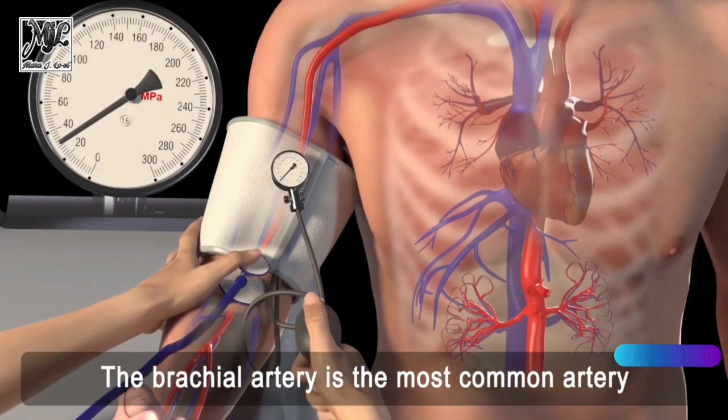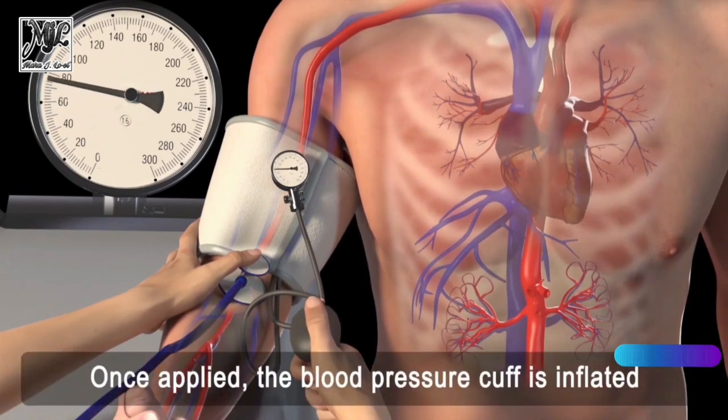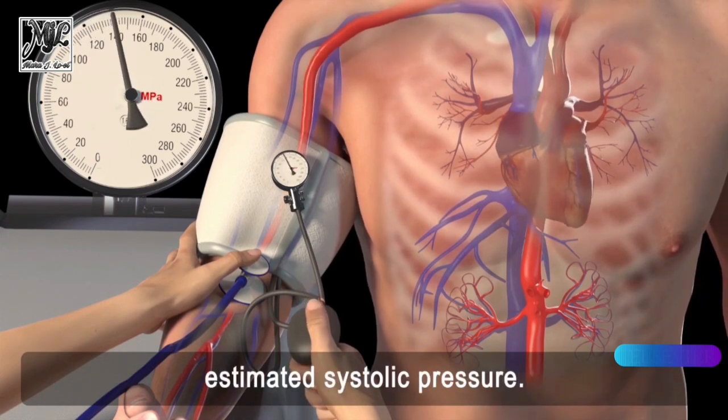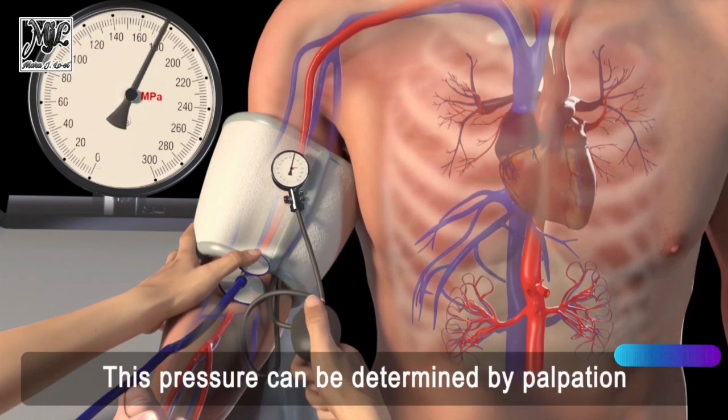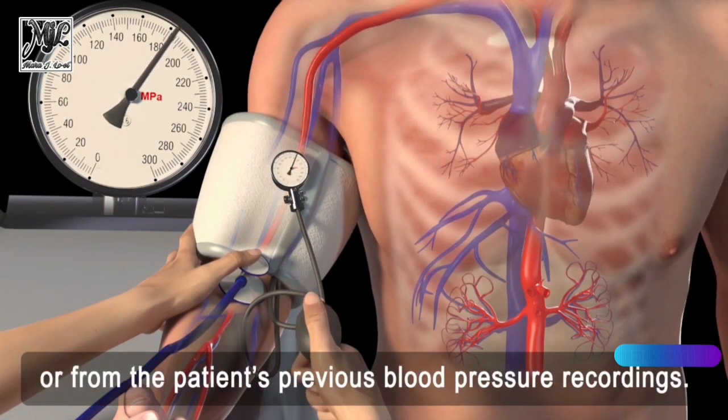The brachial artery is the most common artery used for blood pressure measurement. Once applied, the blood pressure cuff is inflated to a pressure above the patient's estimated systolic pressure. This pressure can be determined by palpation or from the patient's previous blood pressure recordings.